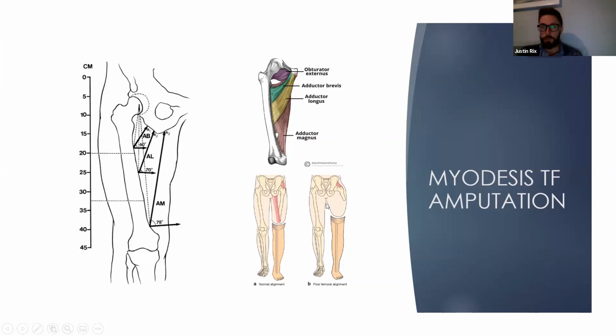She would end up with quite an adductor roll, and would have some issues with circumducting as she goes through the swing phase, and there's a lot of lateral pressure against the distal end of the femur.